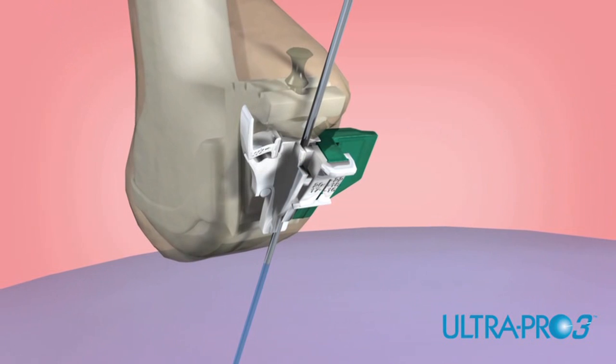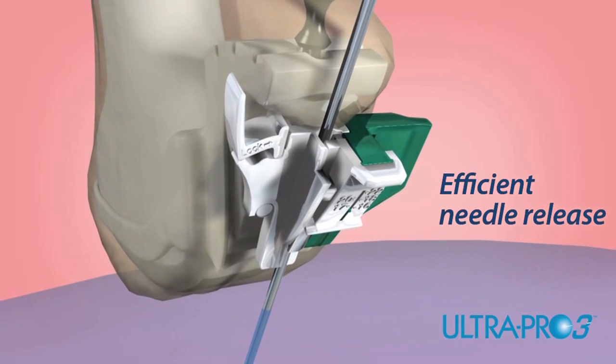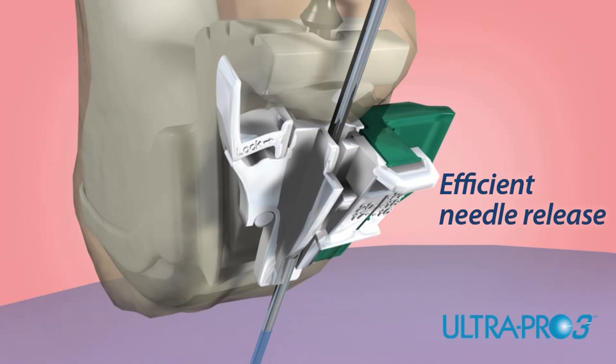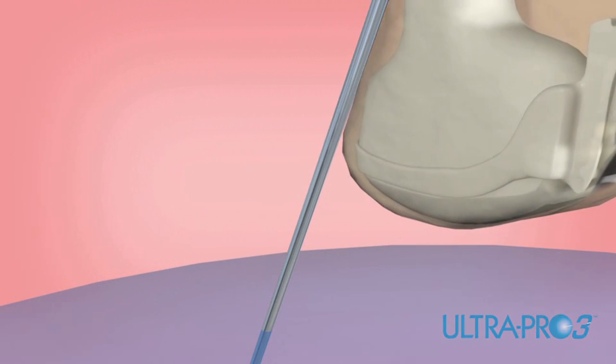Offering greater flexibility, the UltraPro 3 needle guide allows users to quickly detach the needle from the transducer during puncture procedures. To activate the quick release, simply press the turquoise lever and move the transducer away from the needle or catheter.